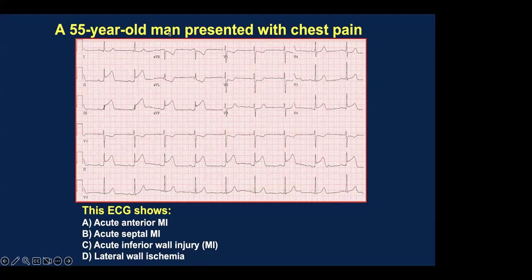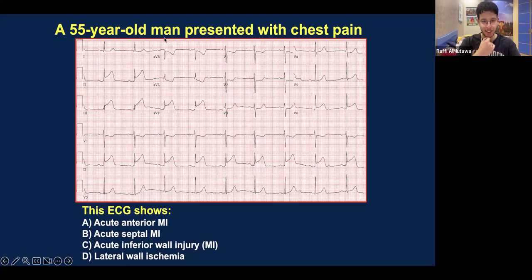I think posterior also, because posterior is supplied by the same artery. Yes. But you are right. We do need to do the posterior leads. So the V7, V8, V9, the posterior leads are very important to do.